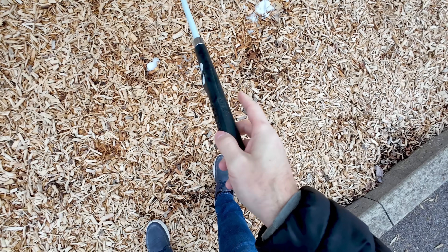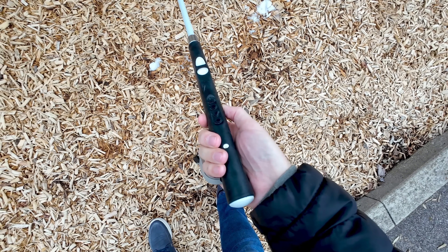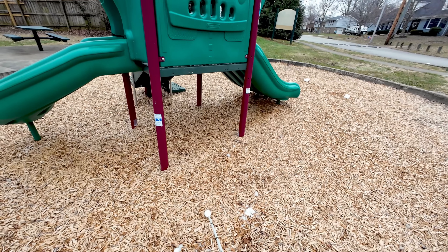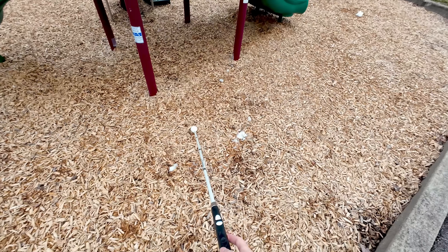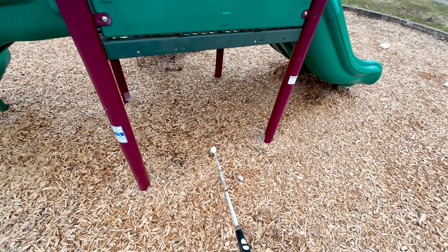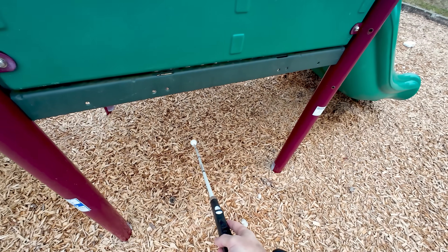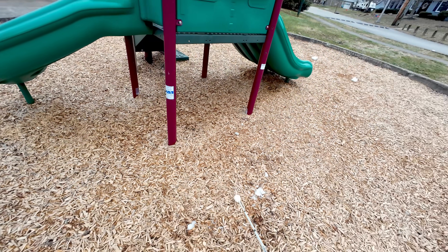To turn on obstacle detection, we use the physical buttons on the side of the cane, and we can choose between three different distances: short, mid, and far — so you can choose how quickly you want to be alerted. Now that I've set it to mid, as I walk up towards this obstacle and my cane goes under it, I'm already being alerted that something is in front of me. And as I get closer, the beeping gets faster, indicating I'm getting closer to the object.